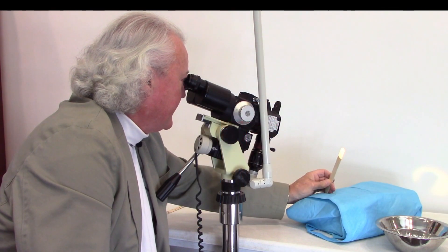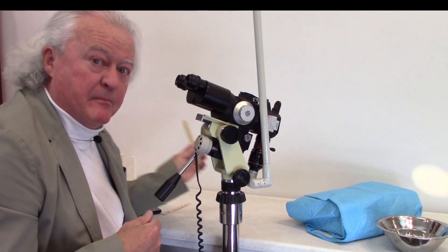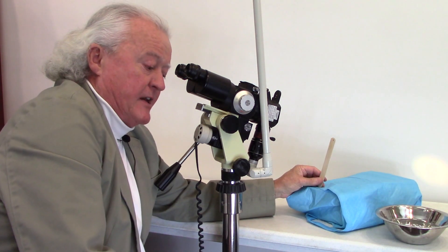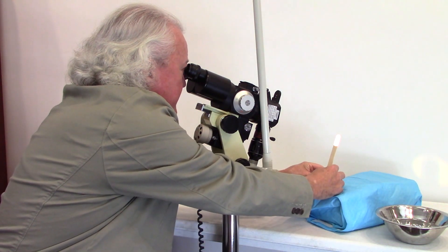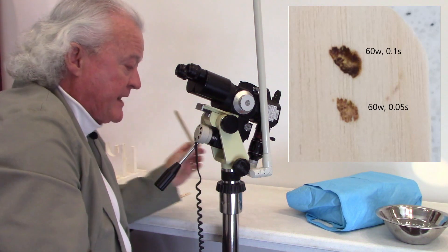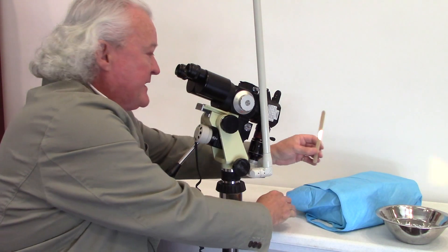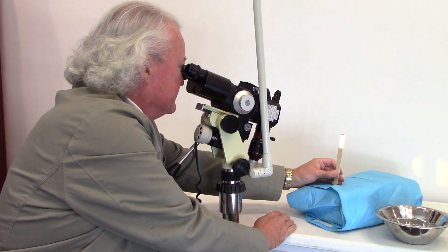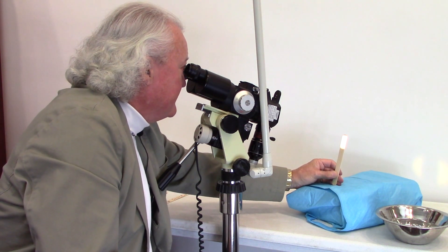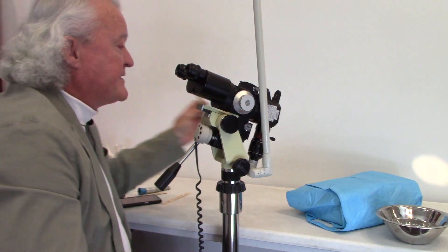60 watts, one tenth of a second — we'll make one shot. Now I'm going to adjust the laser and take the pulse width down to half of that: one twentieth of a second. The laser is now set at 60 watts and one twentieth of a second, and I'll make the test shot just below that on the wet tongue blade. It cleaned it up. Now let's do that again. This particular Coherent laser will go down to one one hundredth of a second — 60 watts at one one hundredth of a second, which is ten milliseconds. We'll place the third shot right underneath there. You can barely even see a mark. With that wet tongue blade, I'm not even making a mark at one one hundredth of a second.